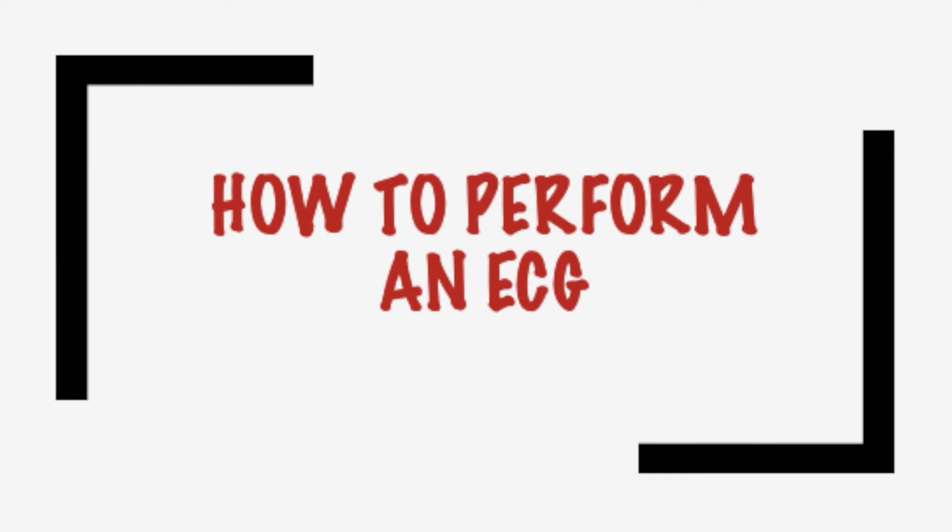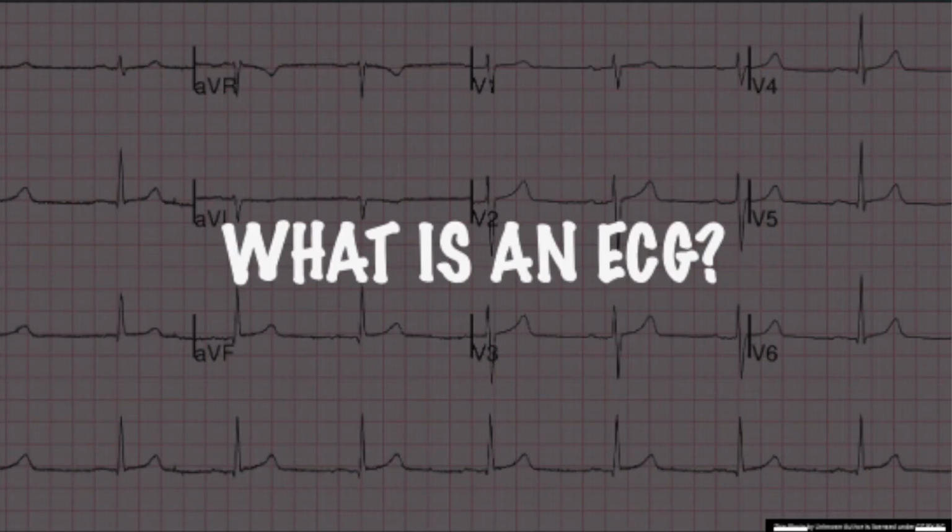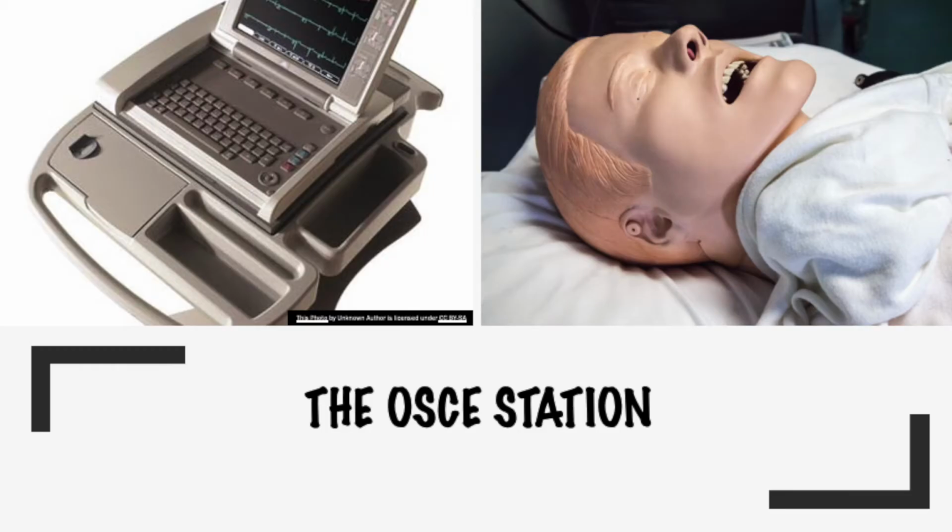In this tutorial we will be covering all things ECG and running through how to approach an ECG in an OSCE station. An ECG is a device used to record the electrical signals of the heart. It is a non-invasive way of diagnosing common heart conditions. ECGs should be performed in patients experiencing chest pain, dizziness, palpitations, shortness of breath, weakness or fatigue, and in those whose pulse is abnormal.